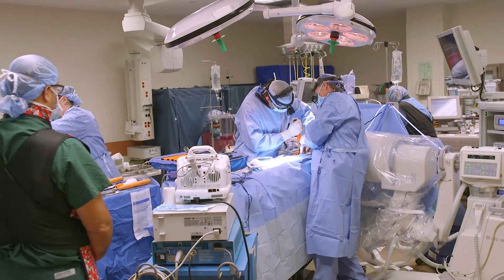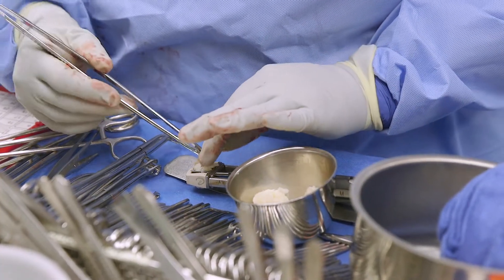Now I want to show you intraoperatively what we've all seen before. So you'll see the exposure, and then you'll see in particular the actual cage itself.